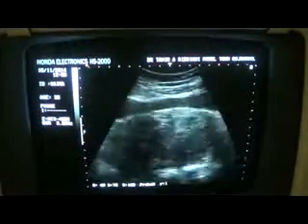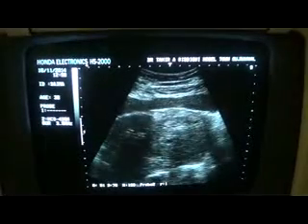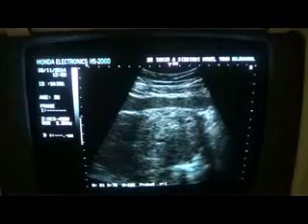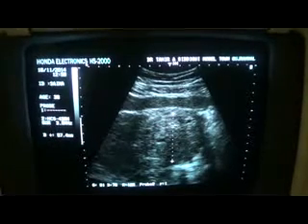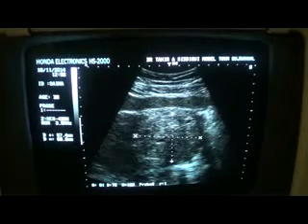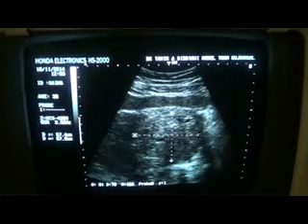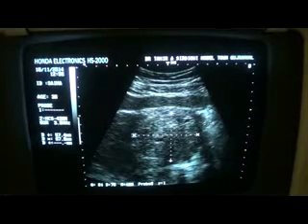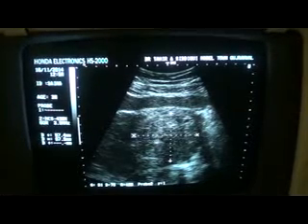And the appearance of the fibroid is very much mixed, cystic and solid. In this area you can see it is measuring approximately, again in this scanning plane, the intrauterine part of this solid echogenic mass, a mixed echo mass with internal cystic areas.